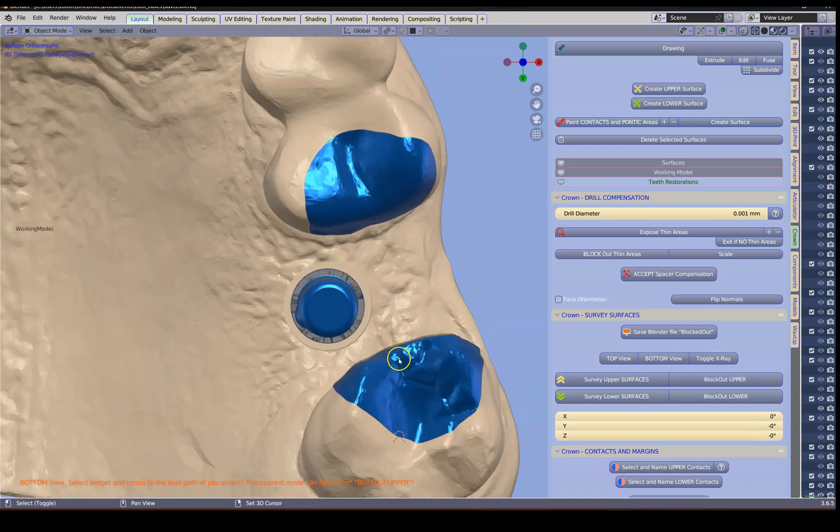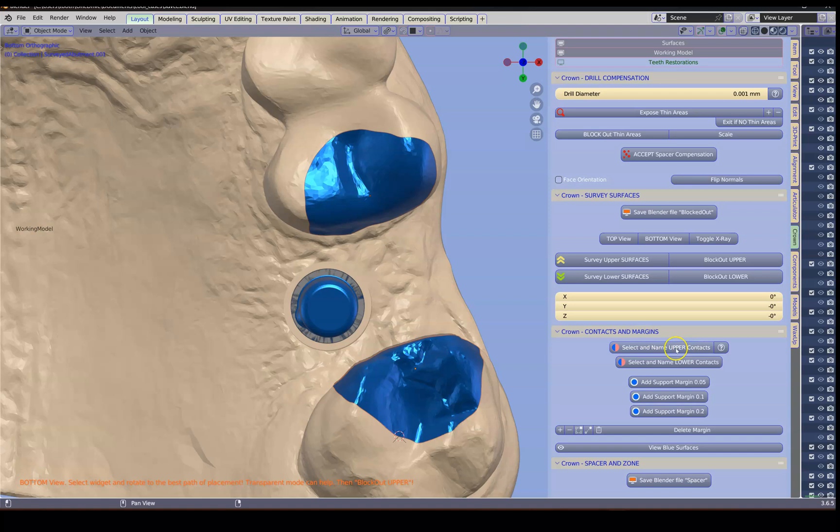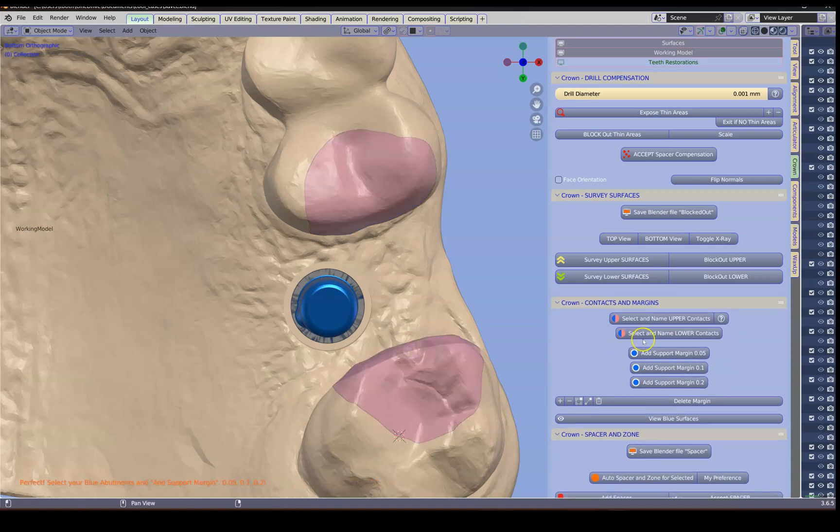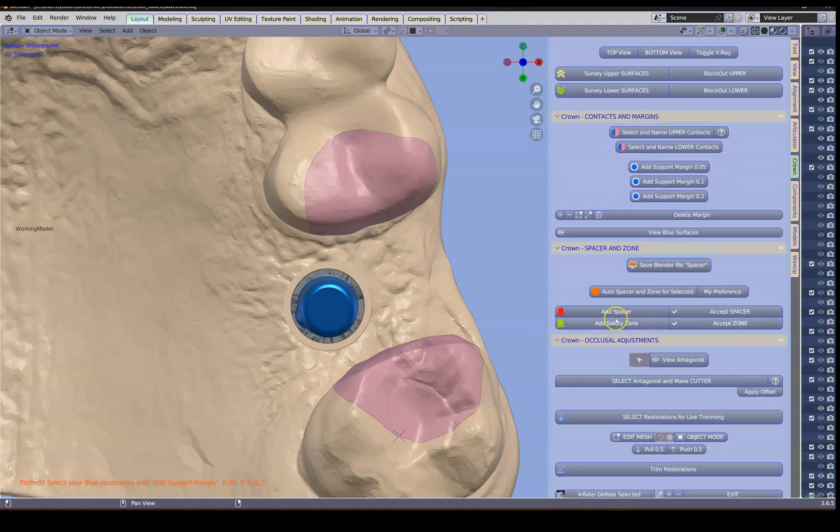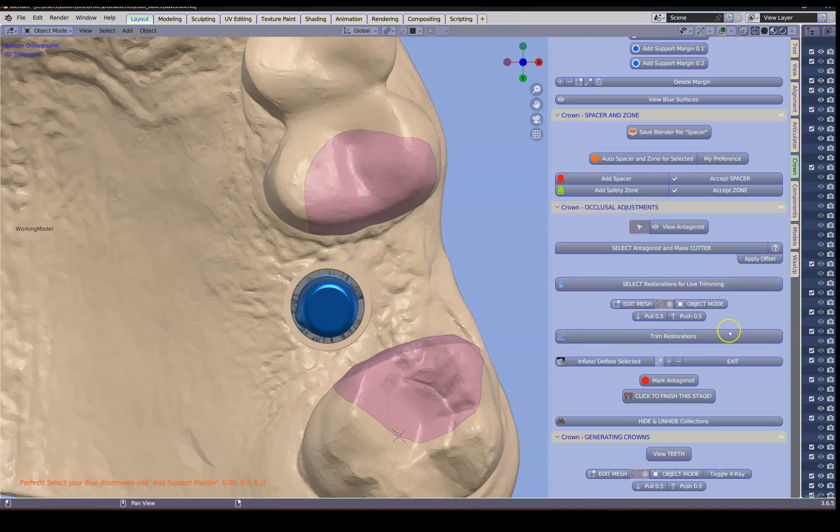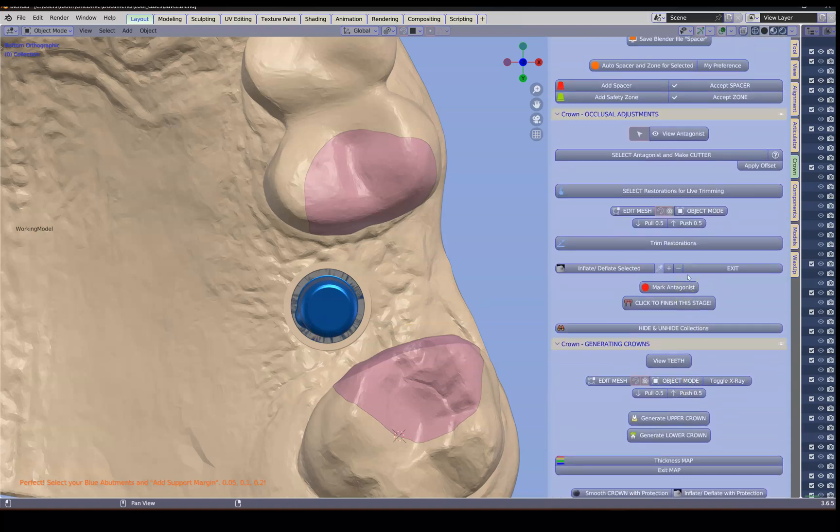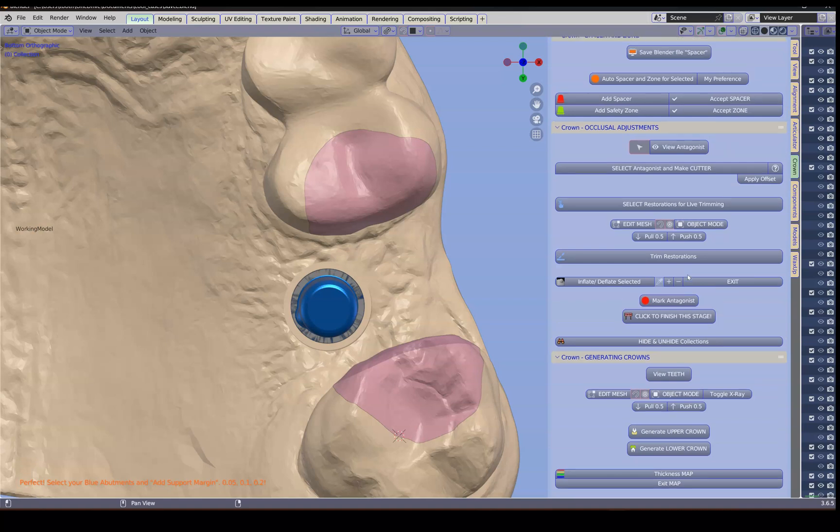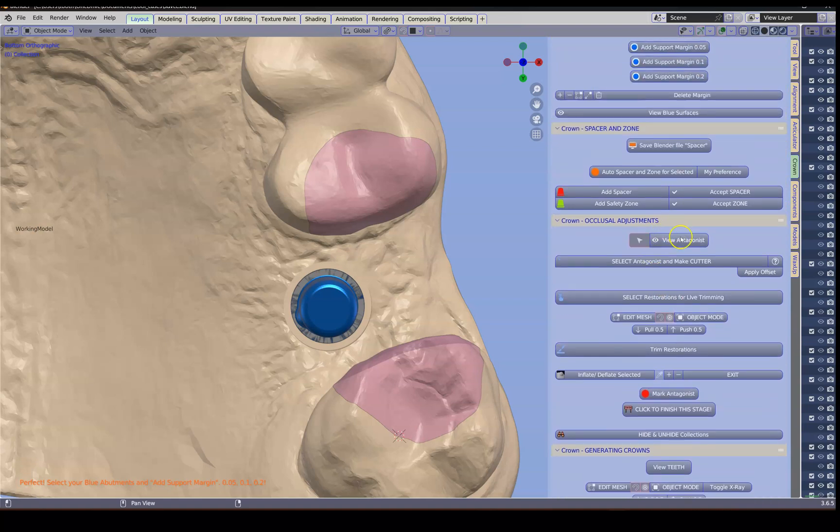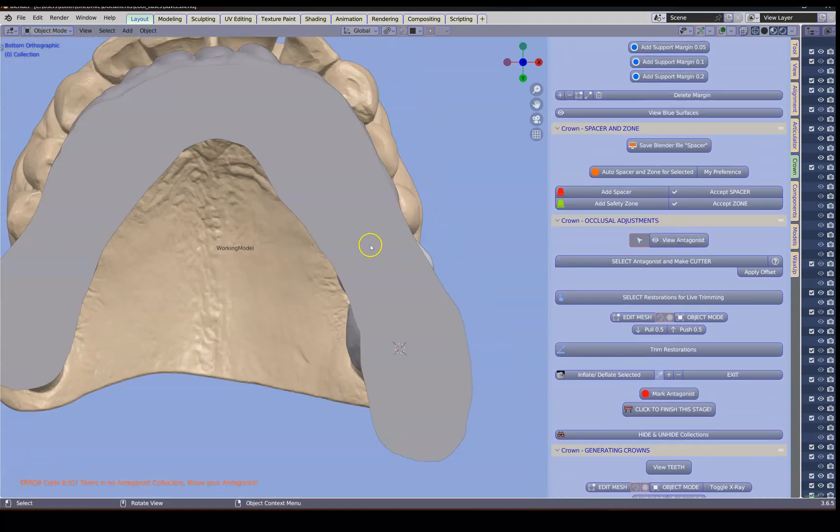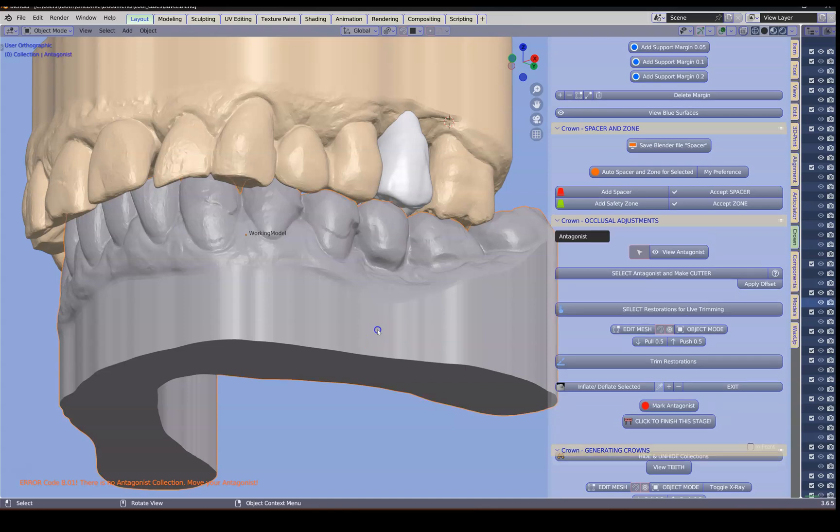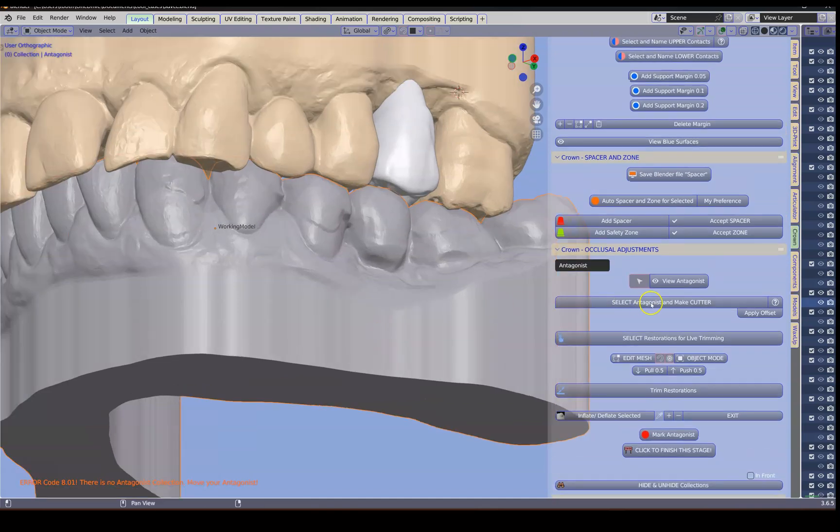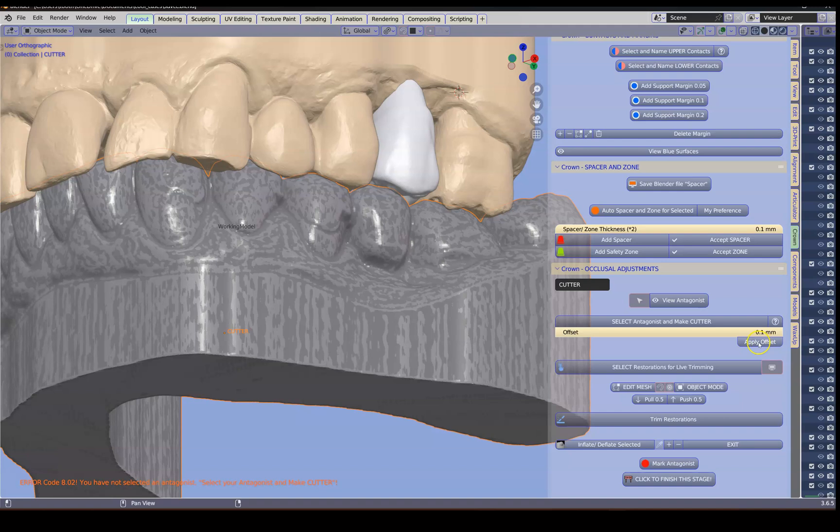We're going to select these. These two. These are our contacts. Next. Then we're going to expose the antagonist. Now the antagonist. We're going to slightly offset that. We're going to apply that offset.